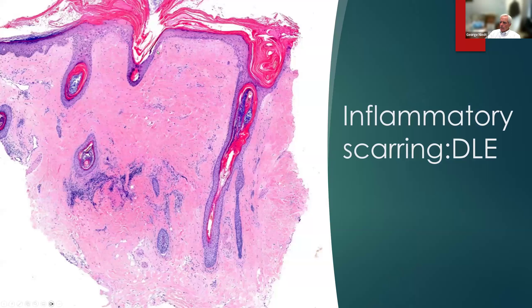Here's another case of inflammatory scarring alopecia — lupus. In lupus, we have loss of pilosebaceous units. In this case, we don't have an interface dermatitis, but we do have some perivascular inflammation, epidermal atrophy, and follicular plugging. Generally it's pretty easy to distinguish lupus from lichen planopilaris because lupus involves more than just the follicle — it usually involves the epidermis, there's usually some dispigmentation, and it's also perivascular.